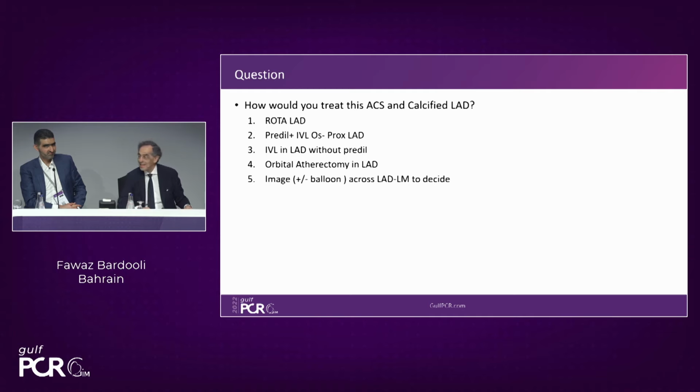One second for this question. Go ahead, Mr. Muhammad. The ECG. I'm interested in the ECG. Yeah, so the ECG actually shows preserved R waves, LAD pattern on the ECG.